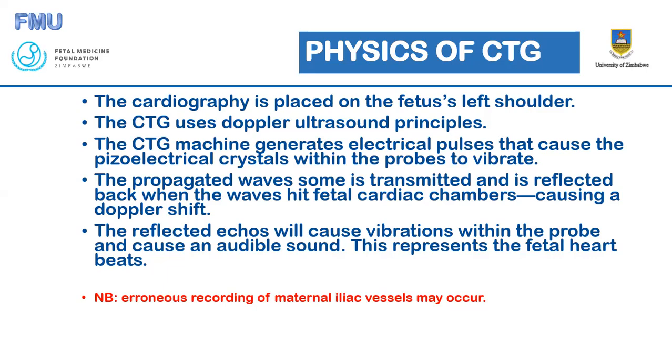Always be aware that you can erroneously record the maternal iliac vessels with the CTG, and you may think the baby has fetal bradycardia.